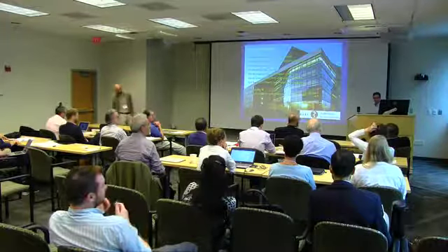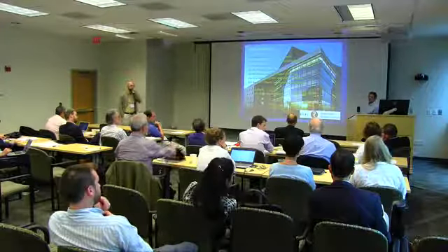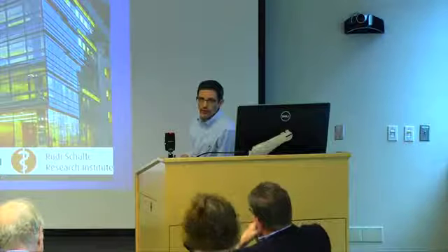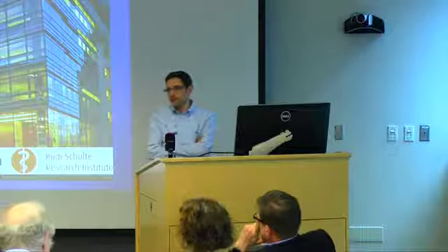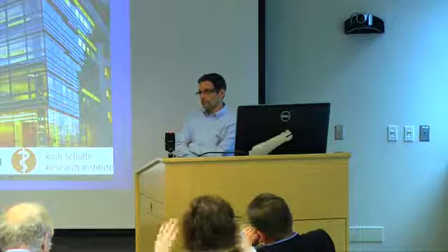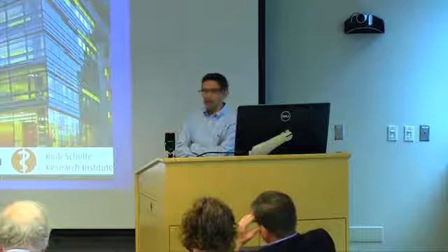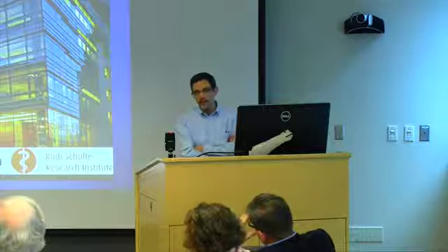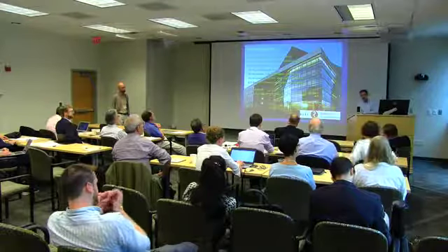Questions for Mark? So Mark, did you measure edema? Because one of the things that does reduce brain or any tissue stiffness is edema or increased water content. How did you measure edema? You said you did diffusion measurements. Did you measure changes in MD or anything? Or did you see it on your anatomical images? Typically in hydrocephalus, you get periventricular edema. So we haven't looked at that carefully. I'm pretty sure we did do DTI, and I think there are changes in MD in the patients. I haven't looked for correlations between those data, so it might be interesting to look at that.